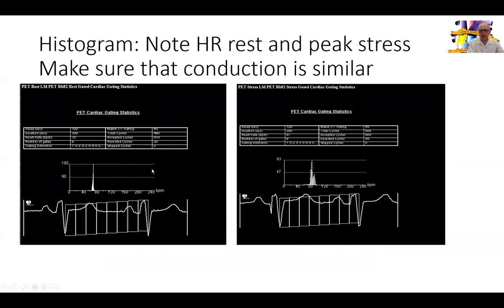Now we go to the analysis of the histogram for the gated images. Rest is on the left and stress is on the right. Heart rate was 70 at rest with a very good histogram, and 87 with stress with some variability but still a good histogram. If the patient were pacing during rest or stress, you would see just a sharp single line in the histogram. This instance appears to be physiologic conduction and not pacing. It's important to review these because patients can transition between pacing and physiologic conduction during the stress test when regadenosine is injected.